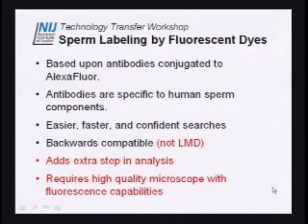What are the downsides to this? One, it adds an extra step to analysis. Right now you're doing your Christmas tree stain and you're looking at the microscope. If you find spermatozoa, you can go ahead and cut them and be done with it. What if you don't? What if you do have a situation where you see maybe 1 or 2 or 3 sperm, you're not sure you really have anything, or you'd rather check a little bit more? It does add an extra step, but it's something that can give you more confident IDs.